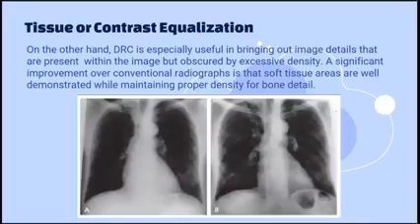For Fuji, dynamic range control is somewhat more involved than simply compressing the grayscale curve. A DRR function sets the range of the new curve to which the original will be compressed. So the DRR function is what compresses the curve. And then a DRT function selects one of the 20 types of software filters to apply to this set of data.